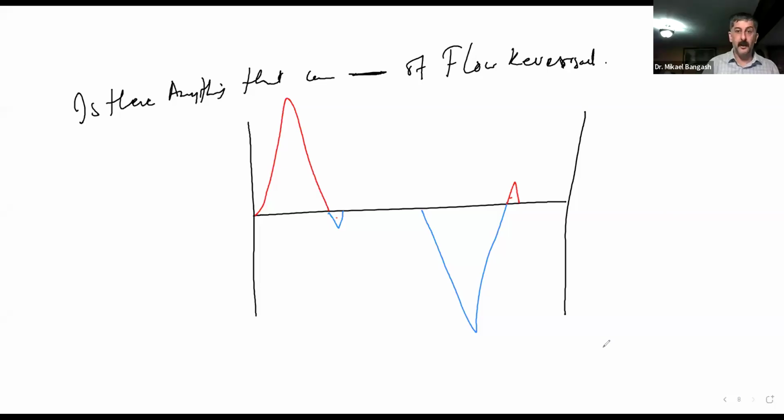So you can eliminate it by the wall filter. Now, Kristen, do you think I'm that nice? But there you go, right? If you're able to answer it now, you can answer it on the quiz. So wall filter.